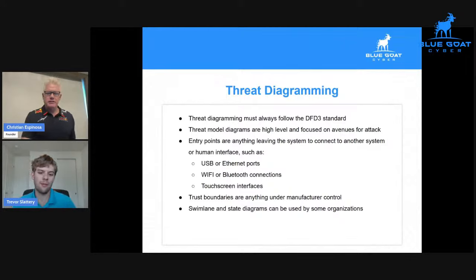Is this threat diagram standard from the MITRE playbook that the FDA recommends, as well as MDR, right? Yes, that's correct. So the MITRE playbook for threat modeling medical devices explicitly calls this out as a good standard to follow. Of course, there are other ones and custom ways of representing different objects. Sometimes it might not cover every type of object, but in general, it'll cover most cases. It'll cover most devices in a simple and concise way.